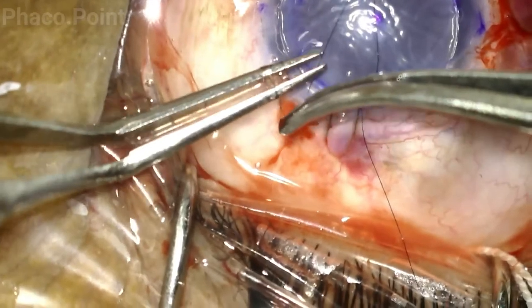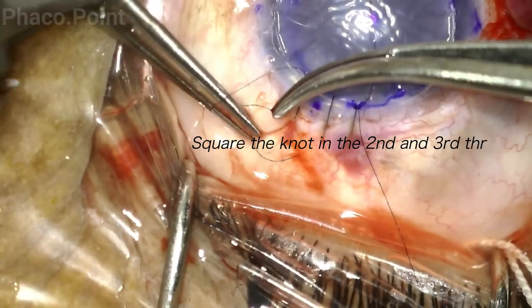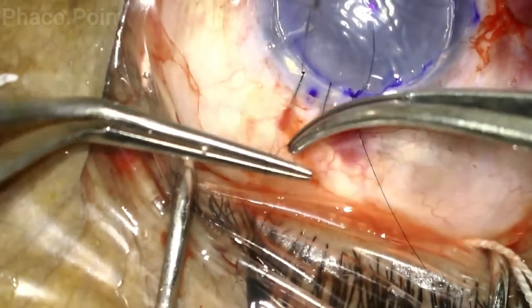Once more, you can see the sequence: a three-throw, tighten, then a one and a one.